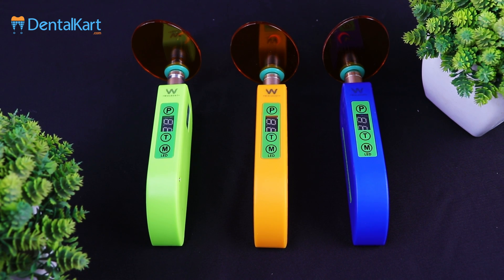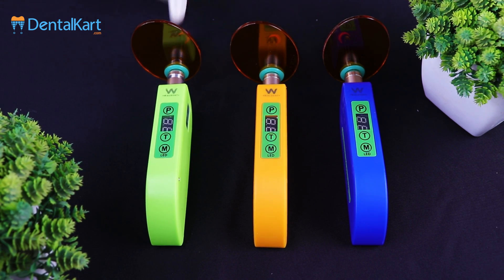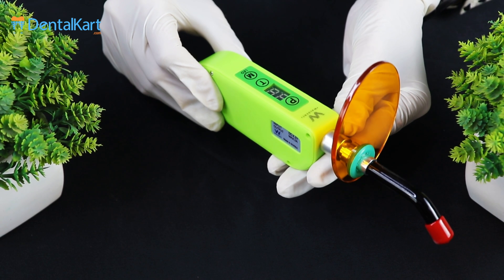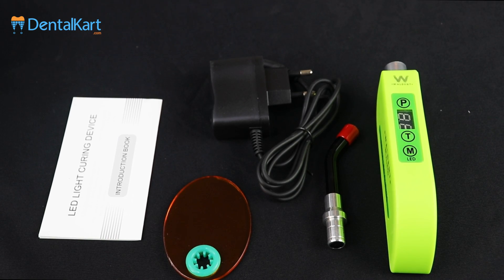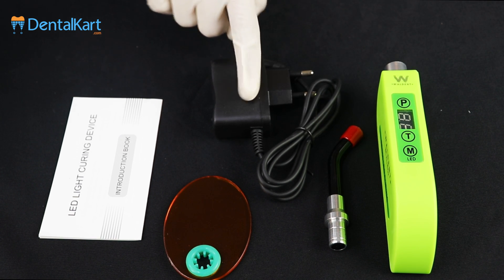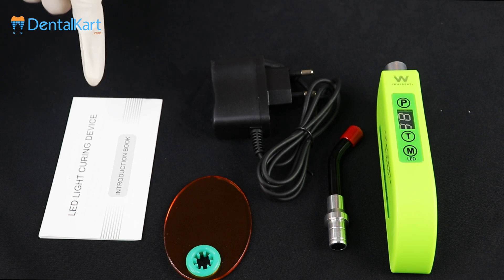Walden Smart LED Curing Light comes in three popping colors: blue, mustard yellow, and green. It has an ultra mini elegant design that makes it convenient for clinical use. The package includes a main unit, fiber probe, charger with adapter, light shield, and an instruction manual.